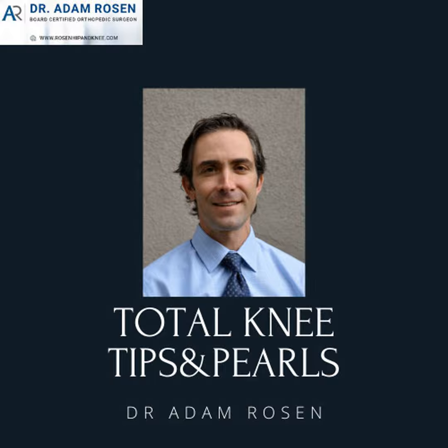A little trick for me, typically I'll always start my incisions for primaries and revisions with a bump underneath the knee of about 8 towels. But once I make my incision on one side, by then flexing the knee up and putting the knee into hyperflexion, it puts the rest of the skin on tension. And then you can use a small pair of pickups or Adsons to help hold the scar and excise the scar on the opposite edge of that border.